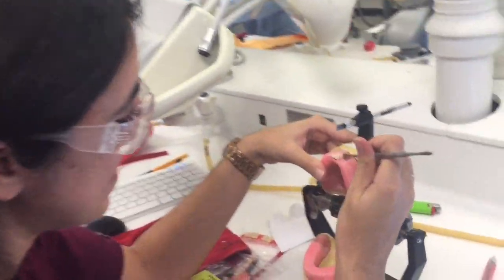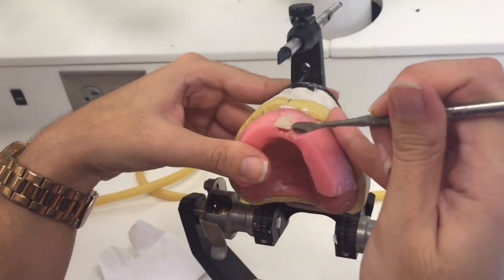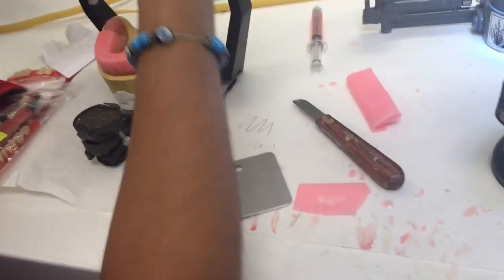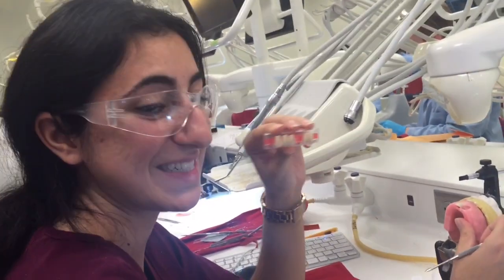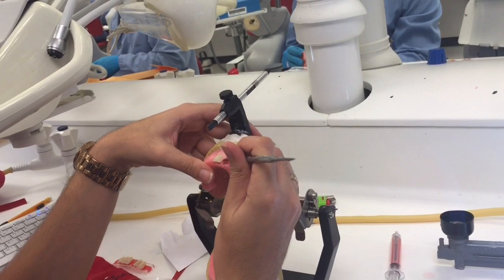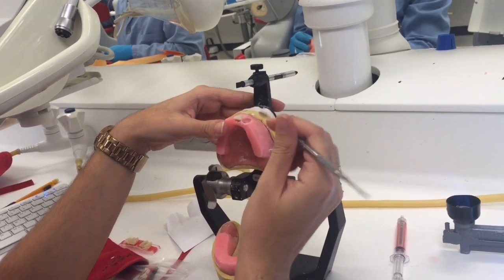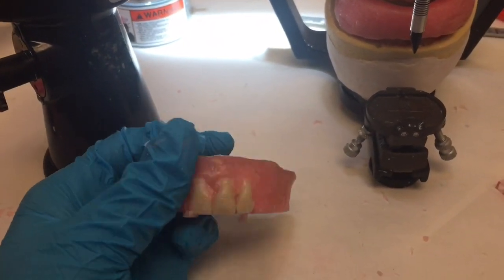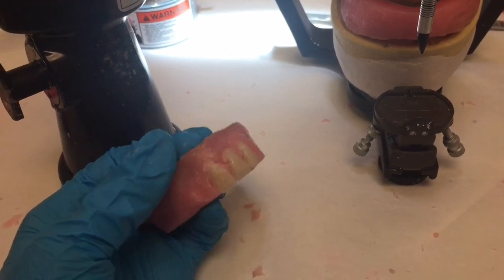We have made dentures — well, we're making dentures — and we're setting our teeth in. Here are my teeth, my maxillary teeth — top teeth. We're setting them in one by one, digging holes into this wax. It's awesome to finally see something close to the end product. It's looking like something now. It's not the prettiest, but we'll clean it up.